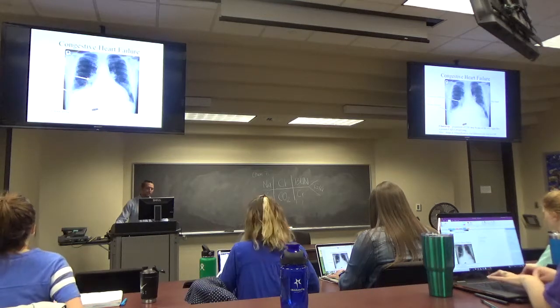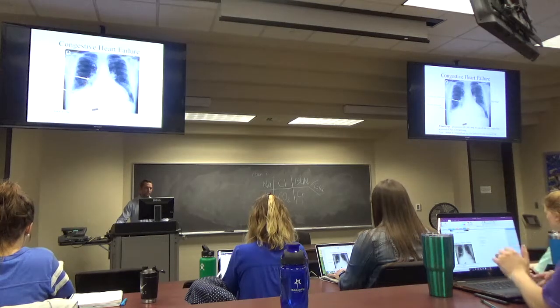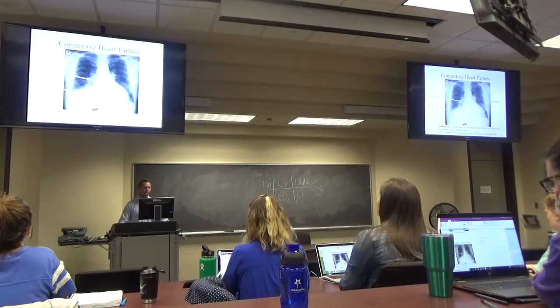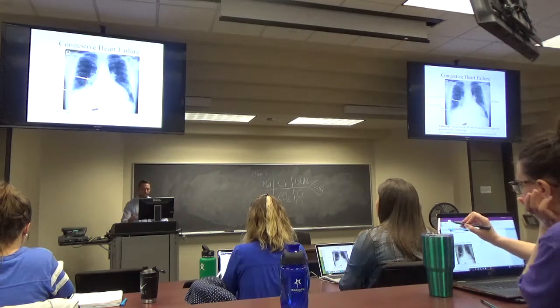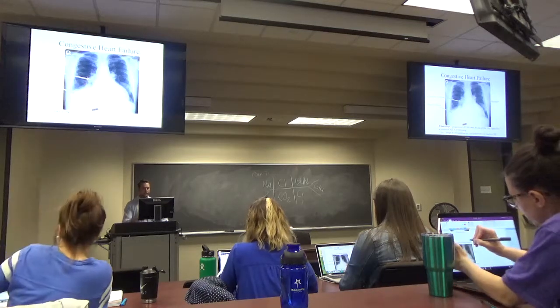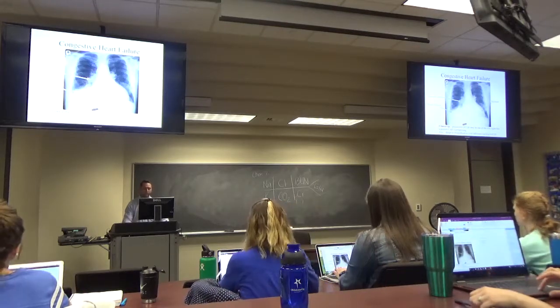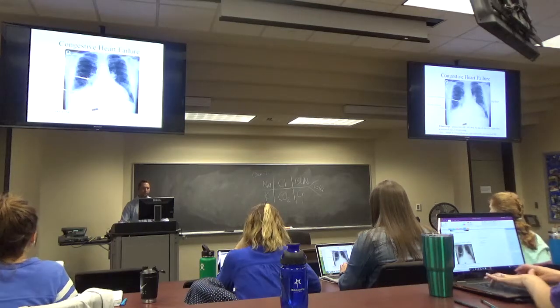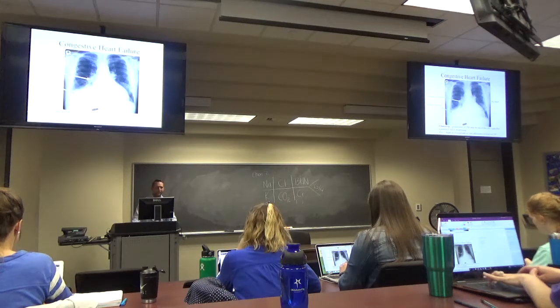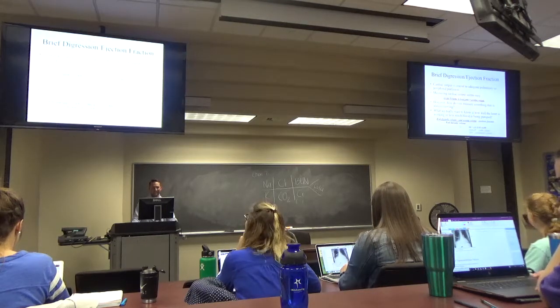The first sign of pulmonary edema is what we call cephalization of the pulmonary vessels, which means, see how this kind of tracks up a little bit? That's a good depiction of cephalization. The progression of CHF may be one of the only signs that a patient's CAD is progressing or getting worse. It says here that viral infections can lead to CHF. That is true, mainly for cardiomyopathies. The main cause of cardiomyopathy is viral infections like Coxsackie. I think it's Coxsackie A, but I don't really remember.